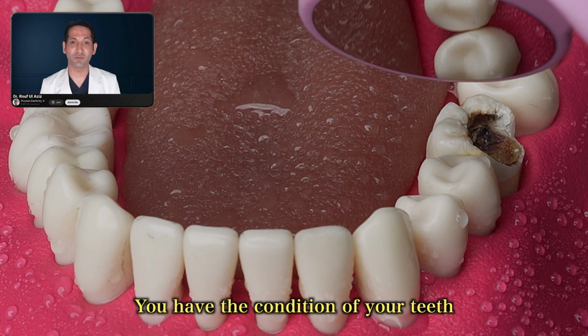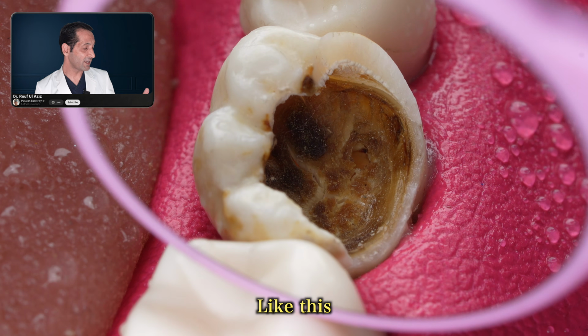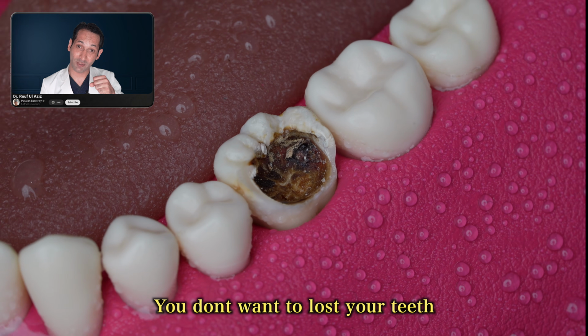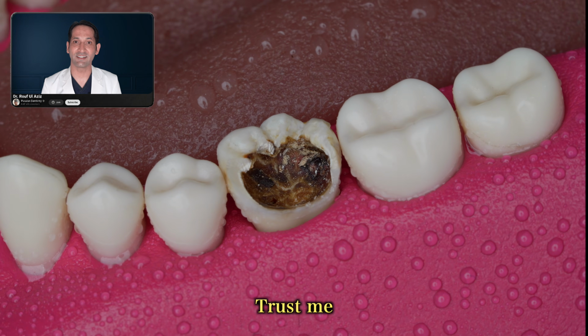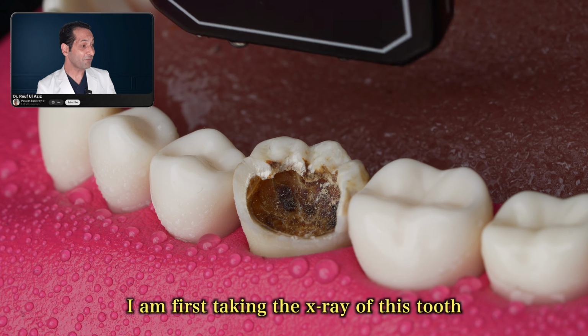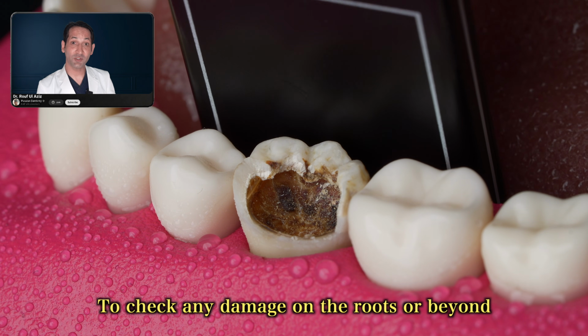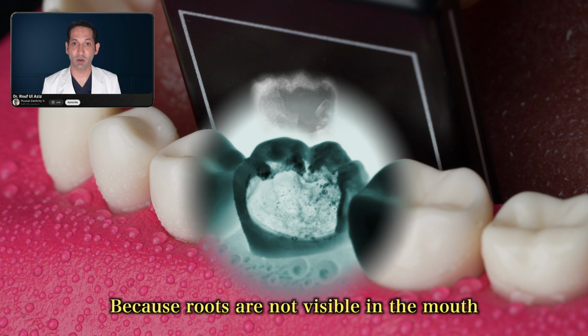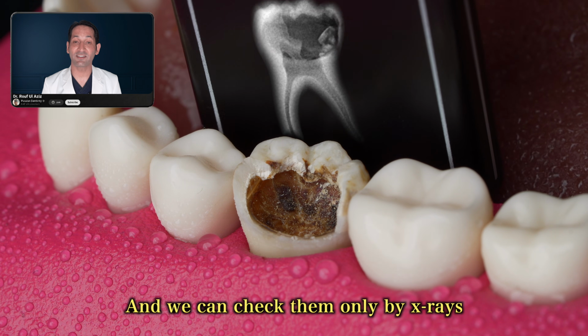You have the condition of your teeth like this and you're really worried about the tooth extraction process. You don't want to lose your teeth. Trust me, you can still save the tooth like this. Let's see how. I'm first taking the x-ray of this tooth to check any damage on the roots or beyond, because roots are not visible in the mouth and we can check them only by x-rays.